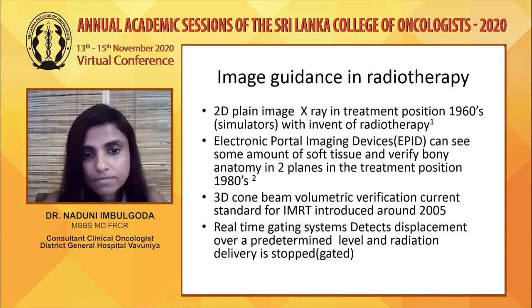So IGRT is nothing new to radiotherapy. With the advent of radiation in the 1960s came the 2D plain X-rays in treatment position, which are the simulator images. And then in the 1980s came the electronic portal imaging devices, where we can see some amount of soft tissue and verify bony anatomy in 2 planes in the treatment position. Next came the 3D cone beam volumetric verification, which is the current standard for IMRT and was introduced 15 years ago, around 2005.